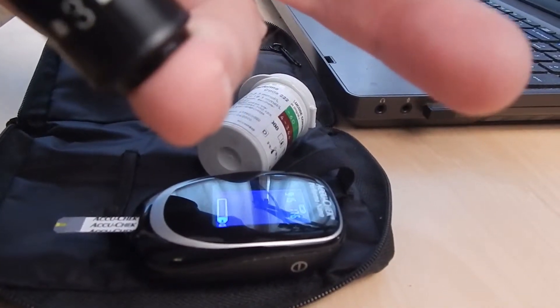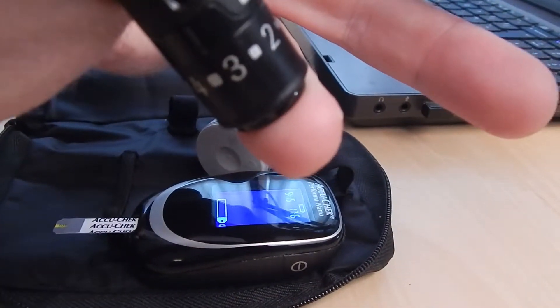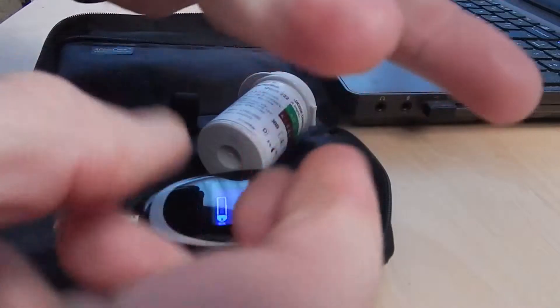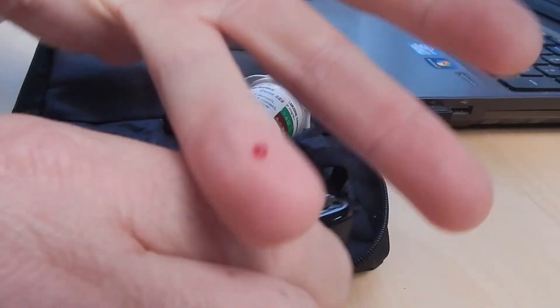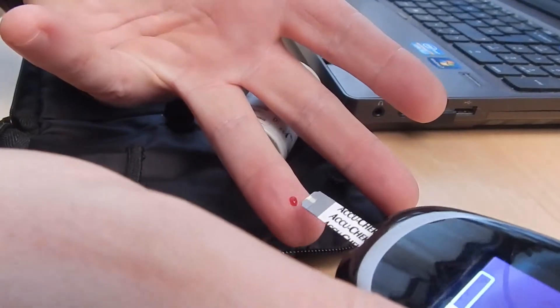I'm stabbing my third finger because it's mostly numb, so I don't generally feel it. It's just a very tiny pinprick — you really don't feel it. Sometimes the blood's difficult to get out, and sometimes it just comes straight out. That was pretty easy.